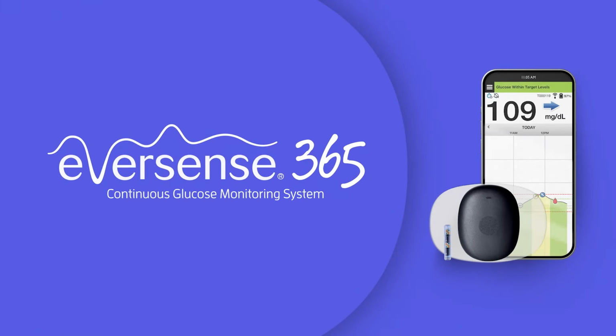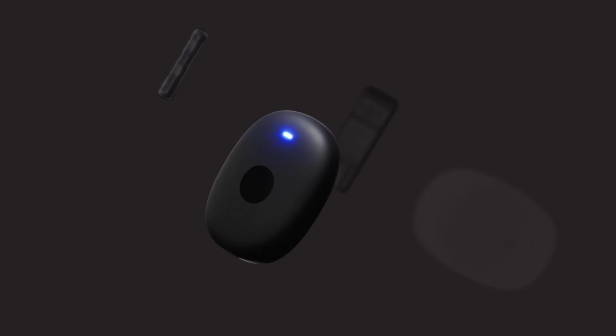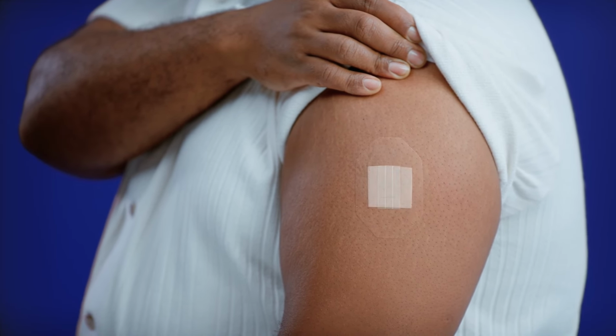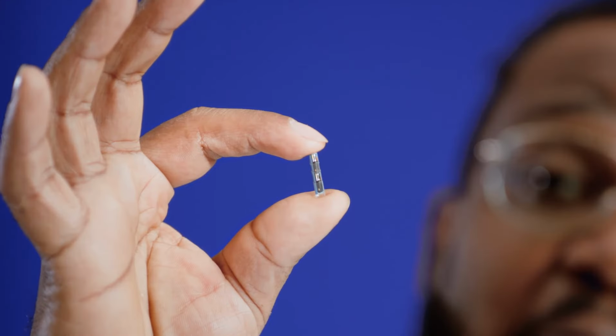Eversense 365 is an implantable continuous glucose monitor that lasts 1 full year. Not only does it last double the time as its predecessor, but it requires less calibrations, just 1 a week, among other improvements. But what about looping? Will this sensor connect to an insulin pump to automate insulin delivery?